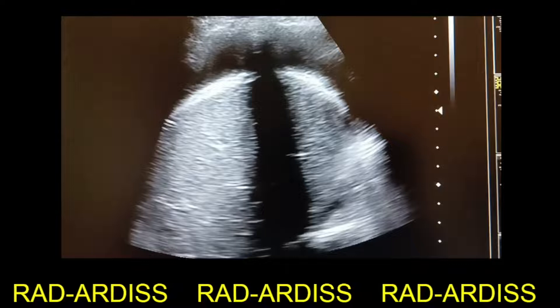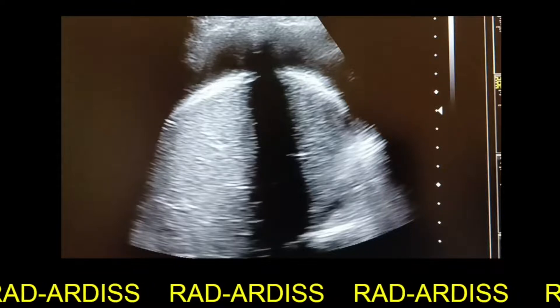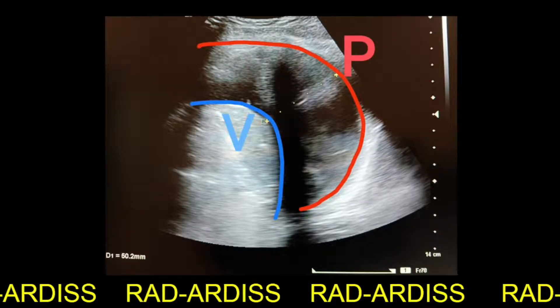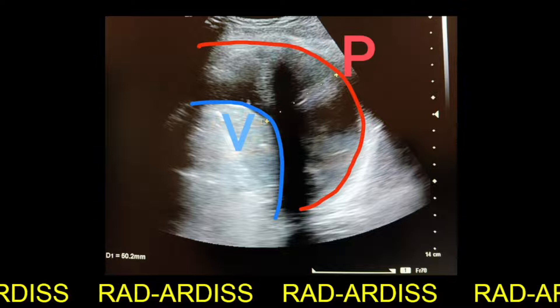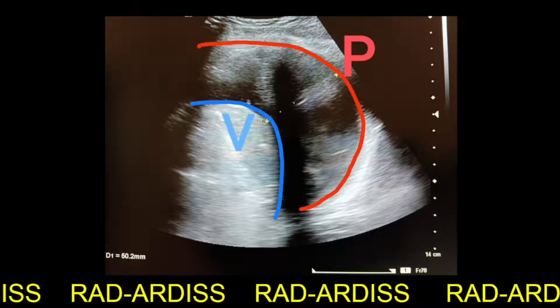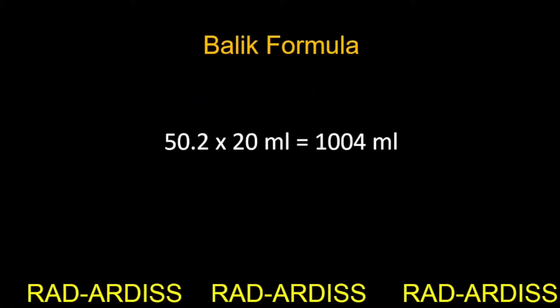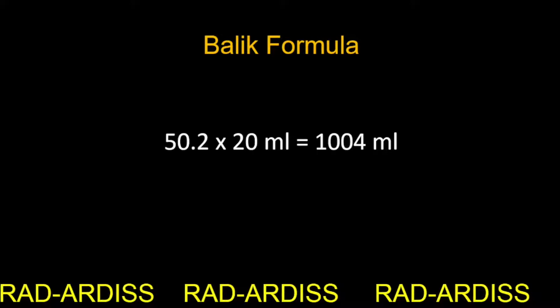In our case, we will sweep the scan from the liver upwards and reach the base of the lung. In this frame, we will measure the maximum distance between the parietal pleura and the visceral pleura. The red curved line is the parietal pleura and the blue curved line is the visceral pleura. The maximum distance between these two lines turns out to be 50.2 mm. So according to the Balik formula, the amount of effusion fluid comes out to be 1004 ml.